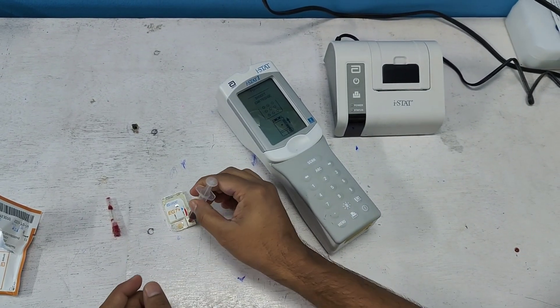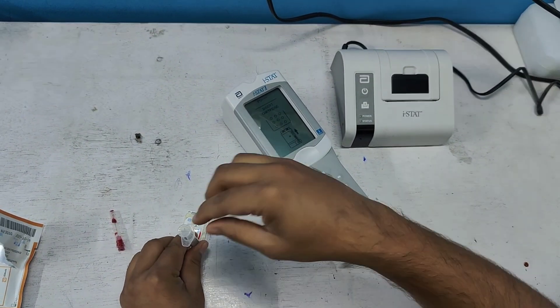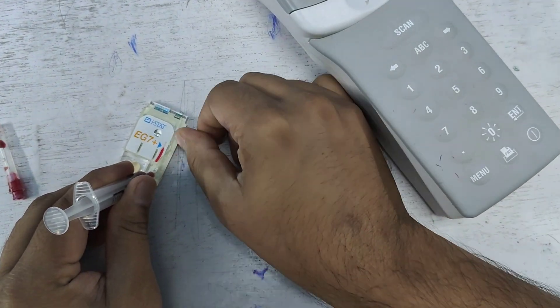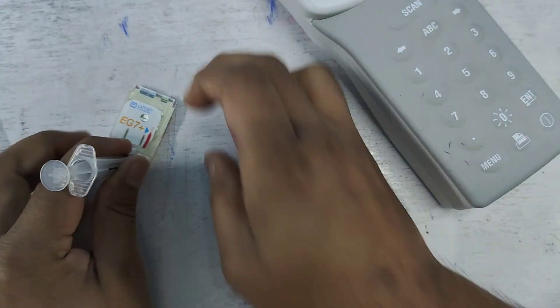I pour the blood into this portion. Have a close look — I have to fill the blood up to this mark. This is very crucial.